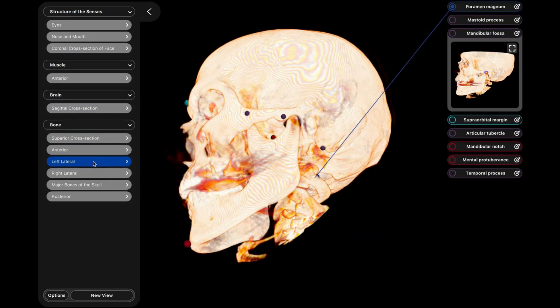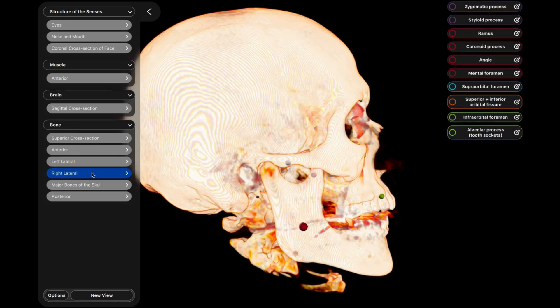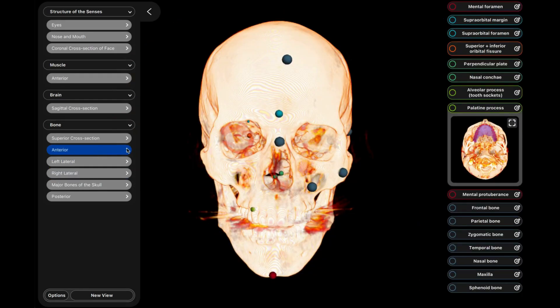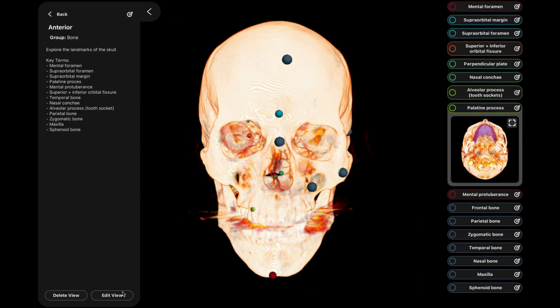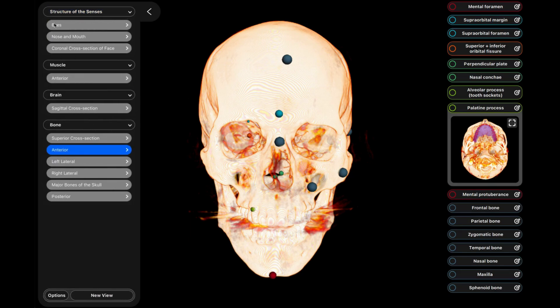To access the editing and exploratory modes, you can either edit a view or create a new view, depending on your needs. In this video, new view has been selected.